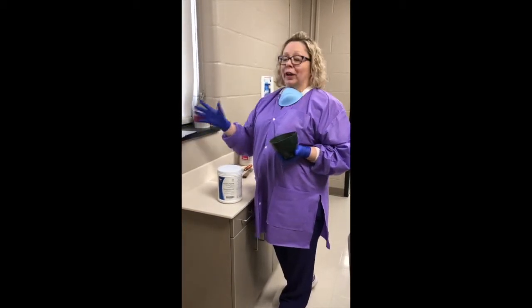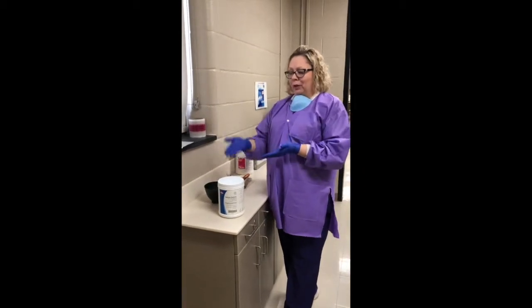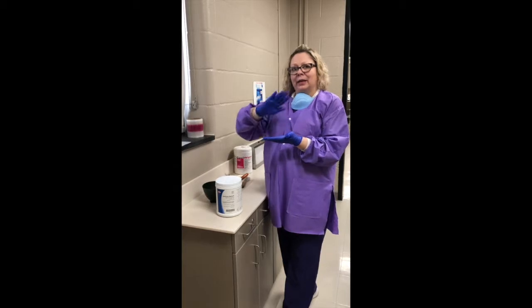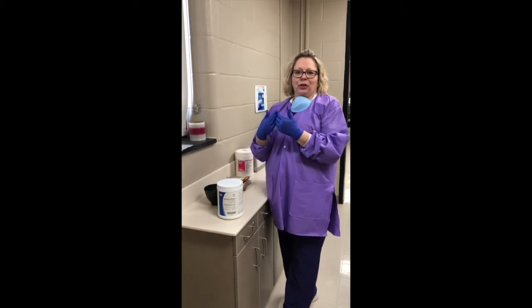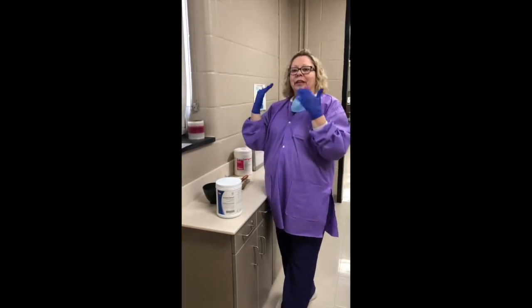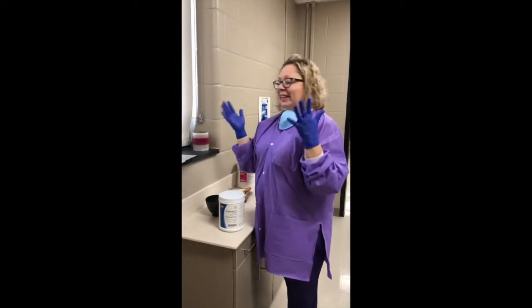Our next objective is to then load the tray. So you would put that material inside the tray. You don't want it piled up really high, because then you've got too much material that's likely to go down the patient's throat a little bit before it starts to set. You don't want too little material, because then you can't capture all the dentition and the palate and the outside buccal areas of the teeth.